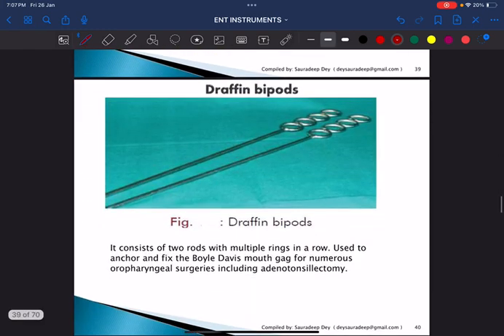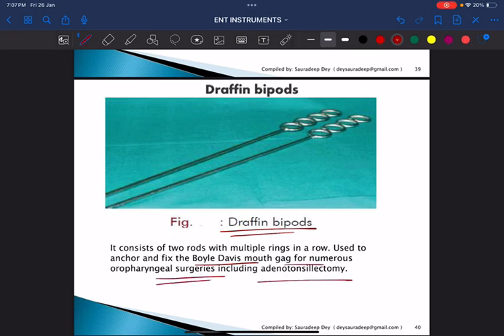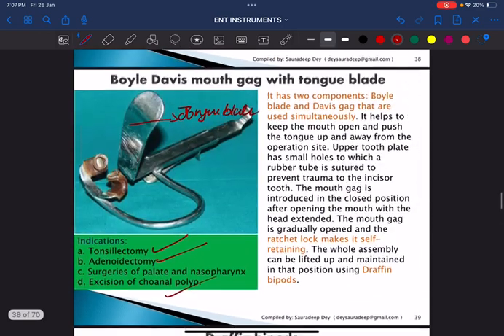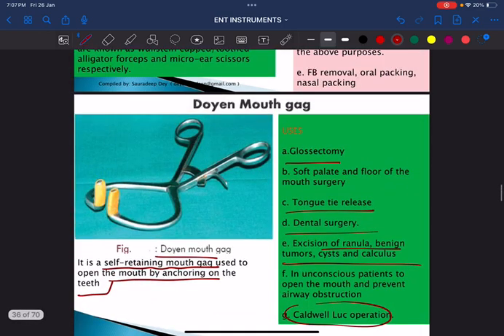This is the Draffin bipods, which helps to fix the Boyle-Davis mouth gag for oropharyngeal surgery including adenoidectomy and tonsillectomy. The three main instruments used in tonsillectomy and adenoidectomy are the Draffin bipods, Boyle-Davis mouth gag, and Doyen's mouth gag.